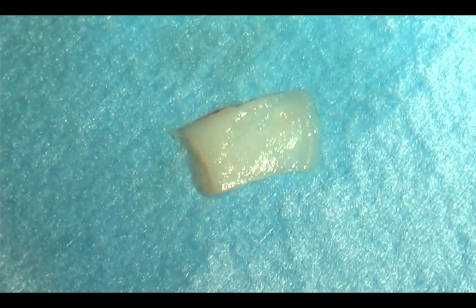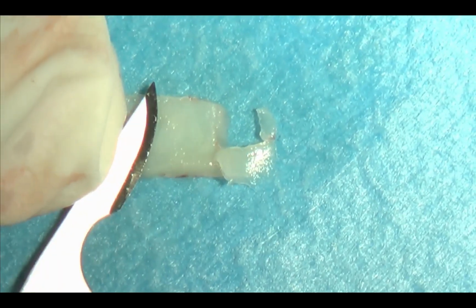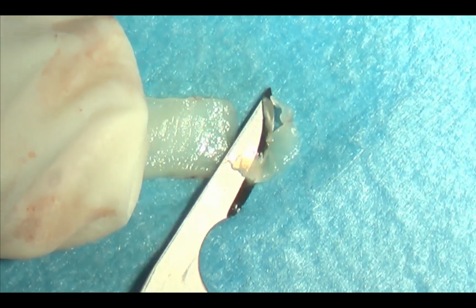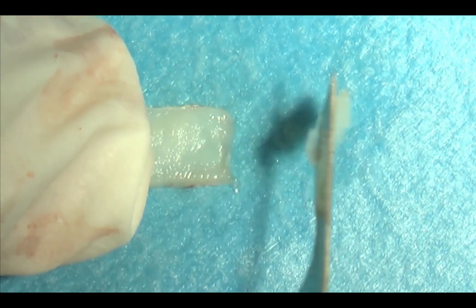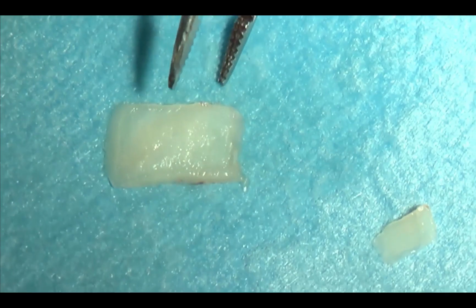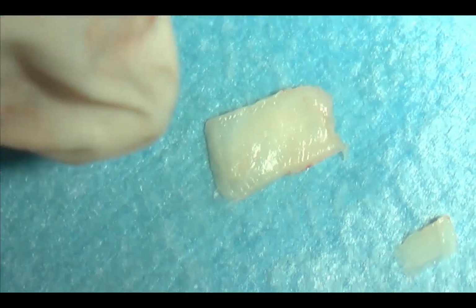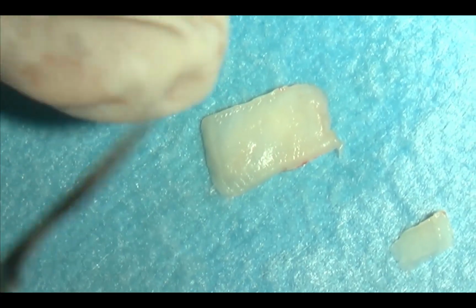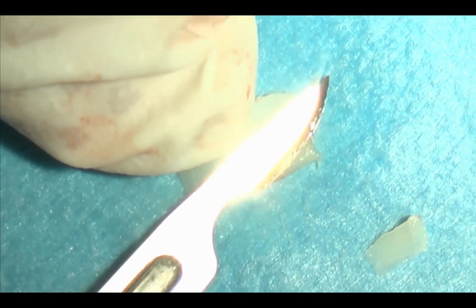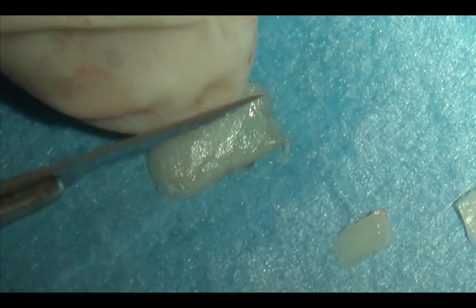Now you turn your graft. Now the apical aspect. Now don't forget to make the cut perpendicular in order to remove some remnants of epithelium in the most coronal aspect where you made the perpendicular and rotation approach.